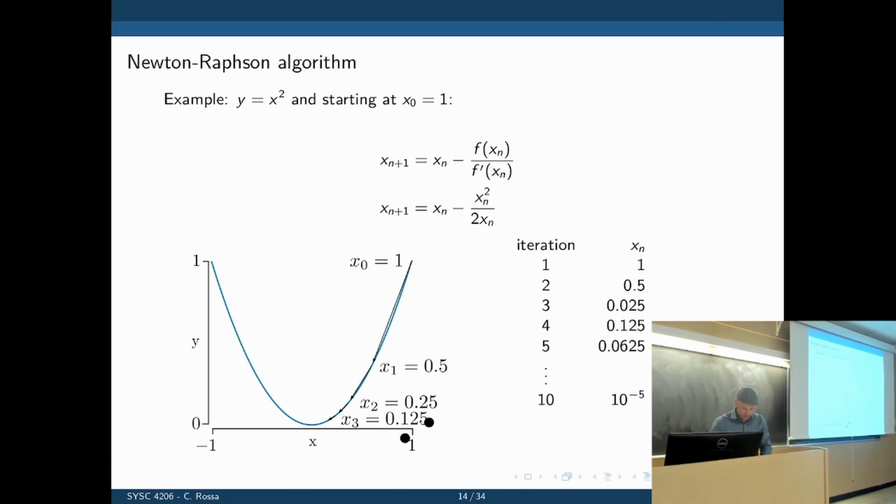All right. So what do we do with all this? We can now finally apply this to our problem of robot inverse kinematics. What's our cost function if we're dealing with a robot problem?